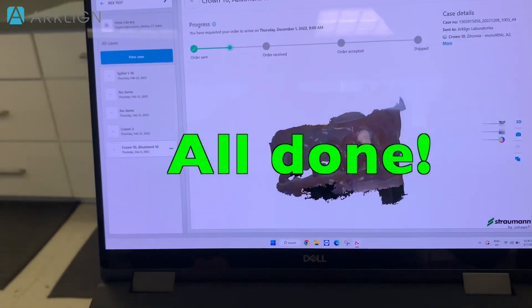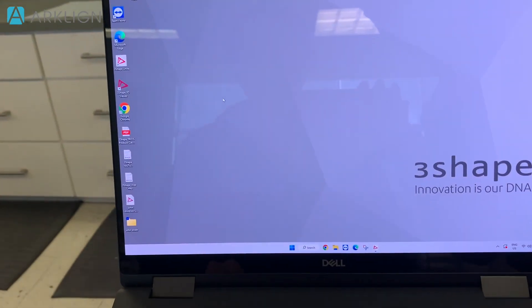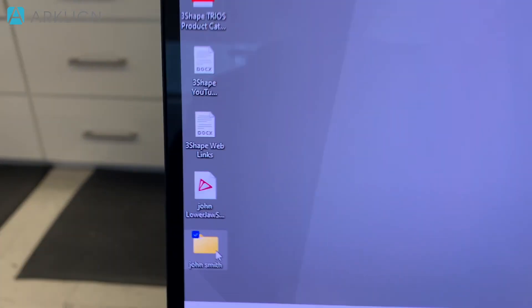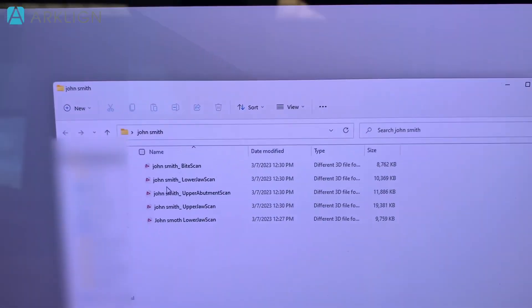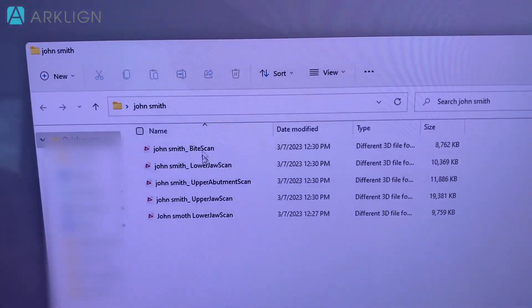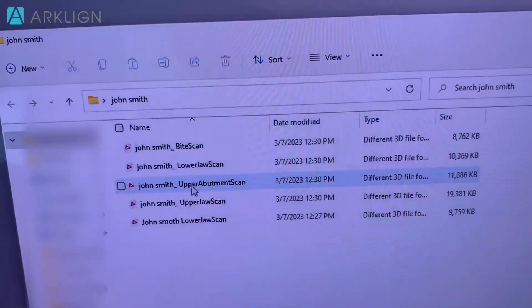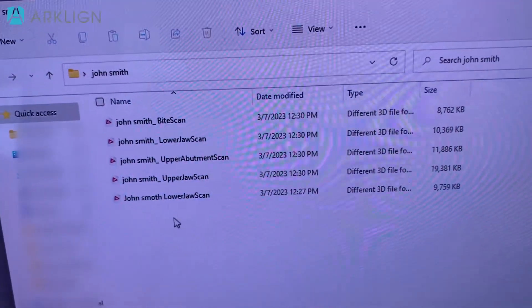To view it I go to my desktop right here and then all the scans for John Smith are stored here.